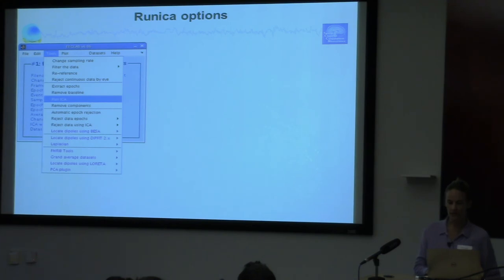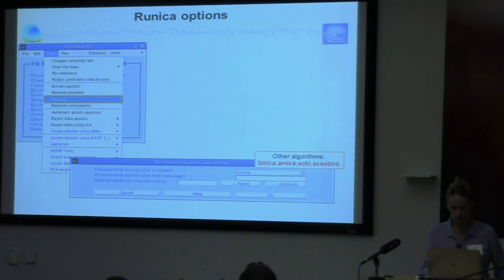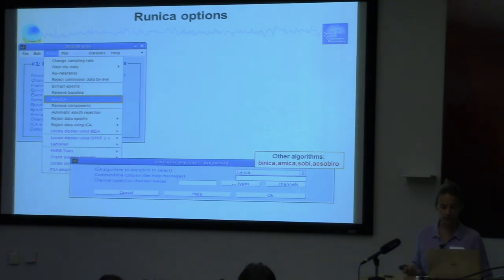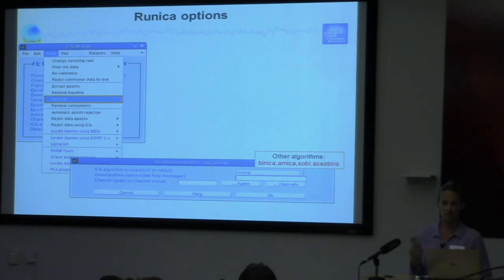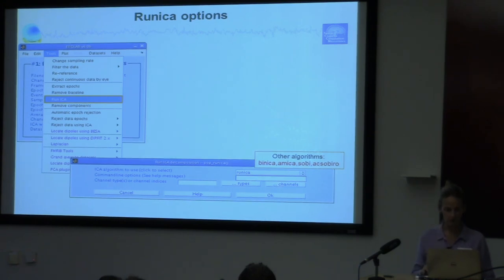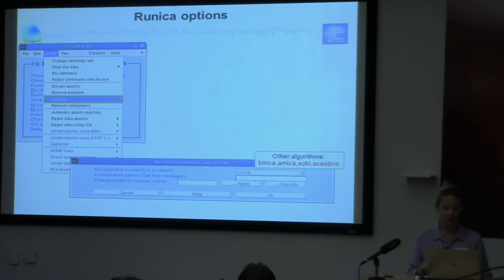The Run ICA option is under the Tools menu. At the top you can choose multiple different algorithms. We usually use runica — that's the standard one. Binica is also very comparable, using basically the same Infomax algorithm but much faster since it runs all the data in Linux in the background rather than in MATLAB. So it's much faster if you want to run through subjects quickly. There are also other algorithms you can play with, but we prefer Infomax.